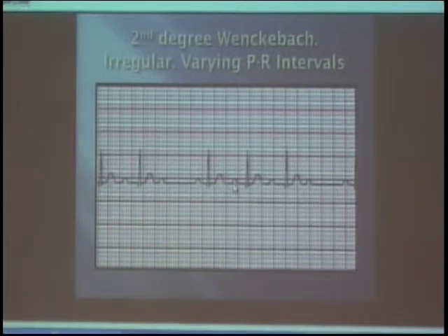There's a PQRST, and then it's going to get a little bit more of a delay, and then a little bit more of a delay, and then there's going to be a dropped QRS.